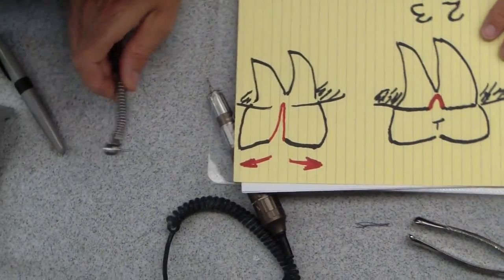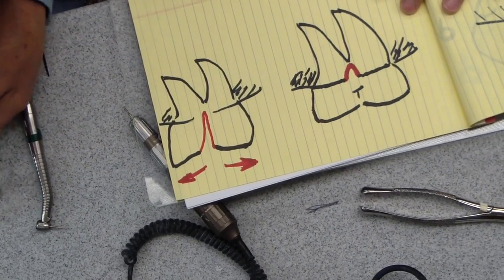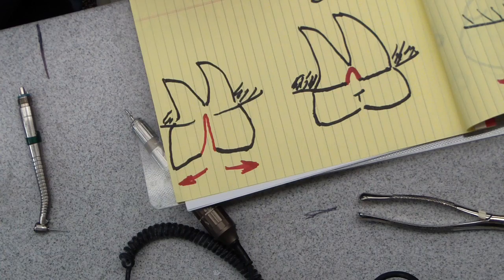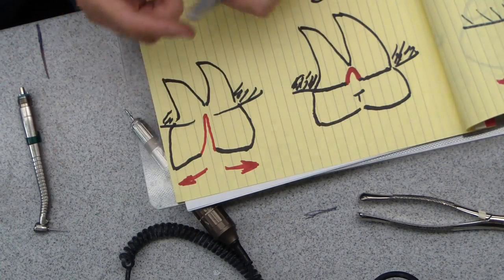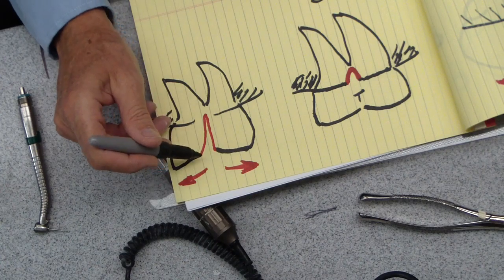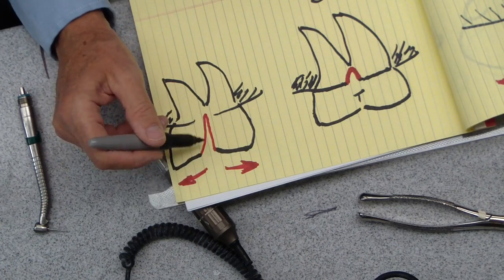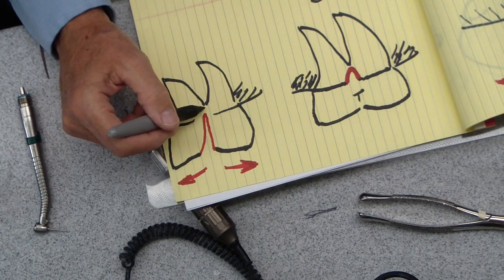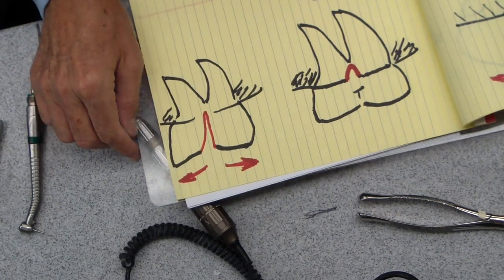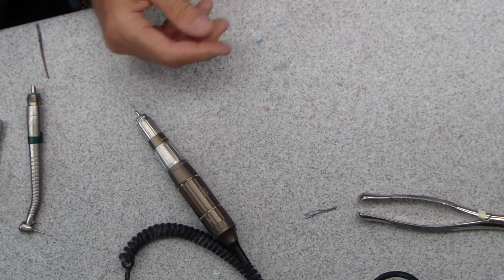I'll just go ahead and section that tooth with a burr right down almost to the furca. Now what that allows you to do, since there's no tooth on either side you can elevate against, you can elevate the mesial part against the distal part there. So by making a slot in there, right from the furca, then you'll create one half of the tooth that you can elevate against the other half.